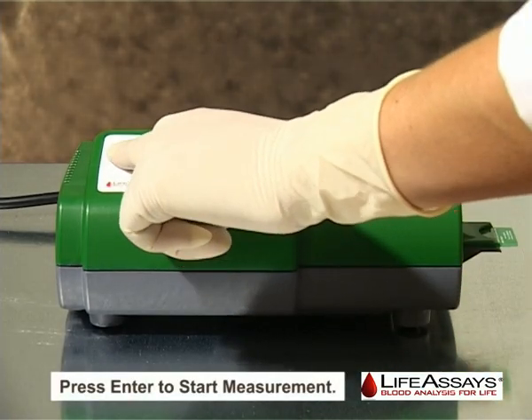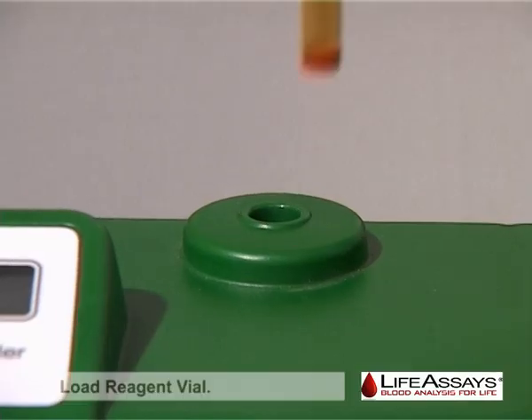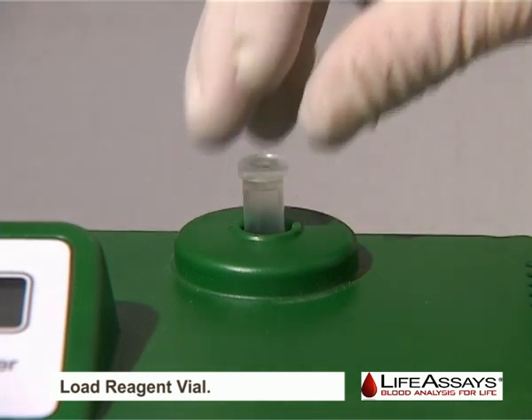Start the measurement by pressing and holding the enter button. Once instructed by the display, load the reagent vial.